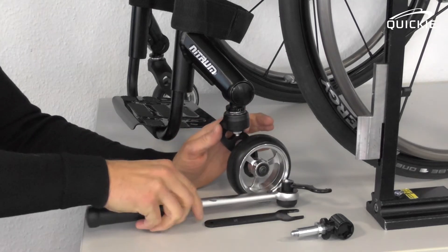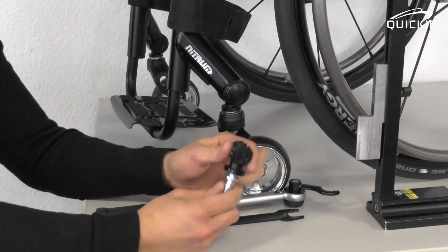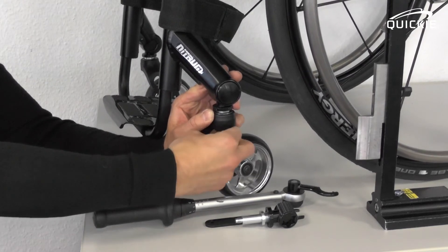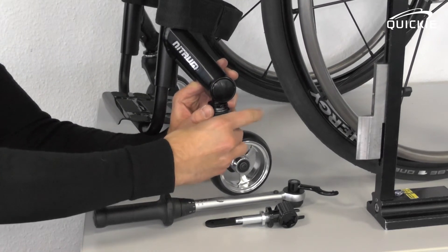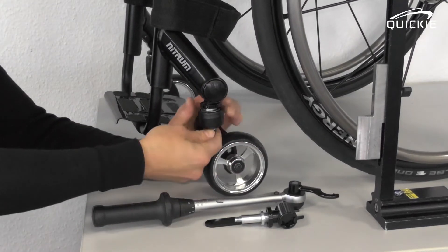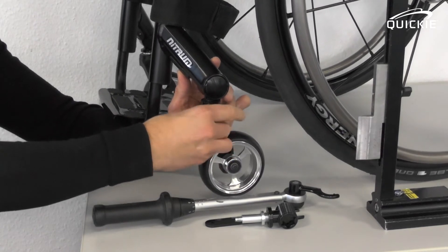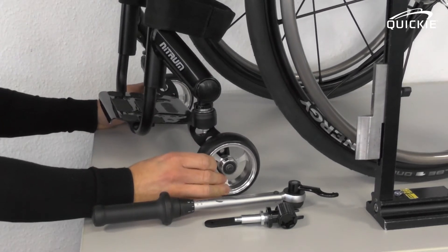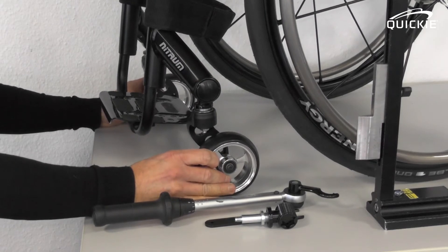Once the round nut is opened, you can simply hold the bottom of the caster stem to rotate the caster stem. Remember, a 360-degree rotation will add one millimeter to the caster height. Rotate it until all four wheels, especially the caster wheels, touch the ground safely again.